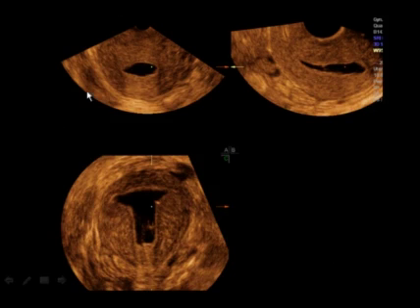Now, this is what you get on a normal sonohysterogram when you acquire it transversely. I have the dot right here, which is the intersection between all three planes, right here and right there. And you can navigate through this entire volume live after the patient is gone, right on your laptop, and view every single part of the endometrial cavity as though you were actually scanning it de novo.